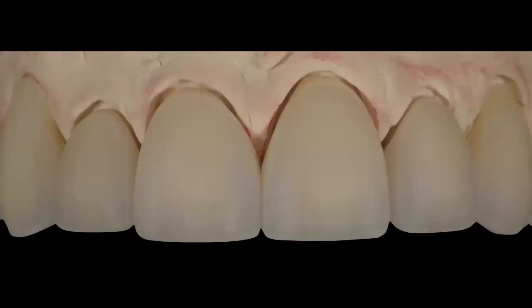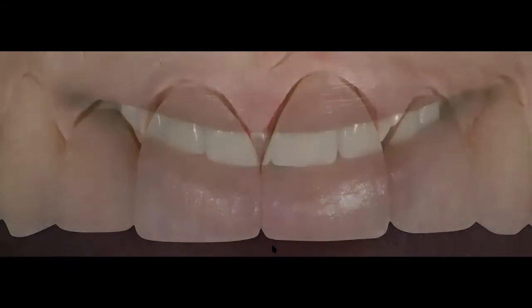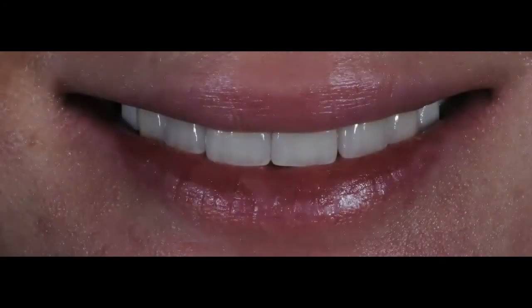But with this more translucent type of restoration, I want you to see these now in the patient. This is the try-in day. I want you to look at this photo, because this is central, lateral, canine. Look at the difference in opacity between my canine and the premolar. You can see it in this photo. Same thing on the other side, but it's more noticeable over here.